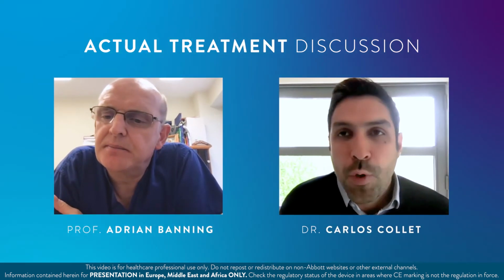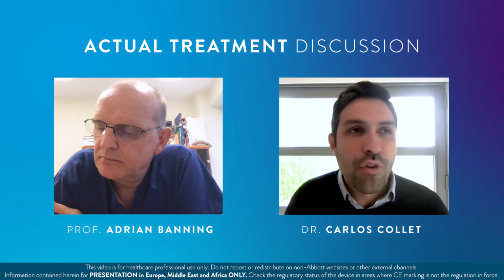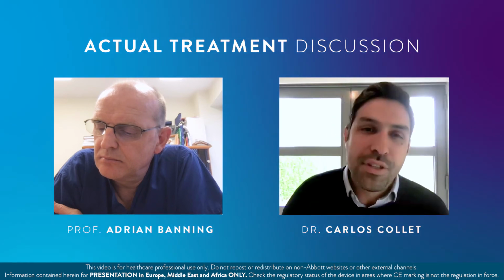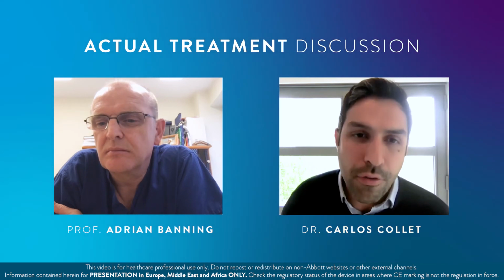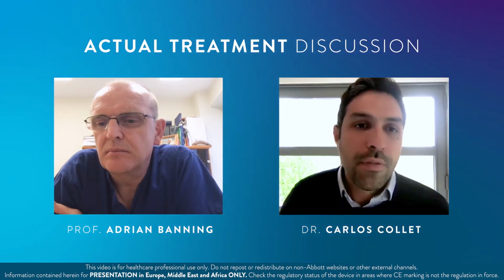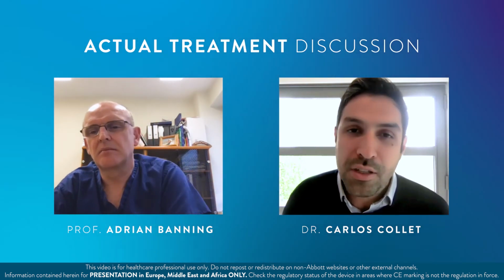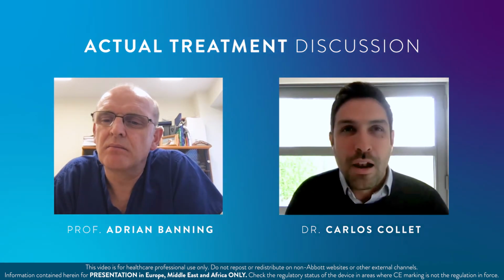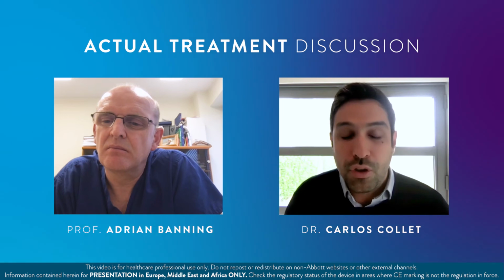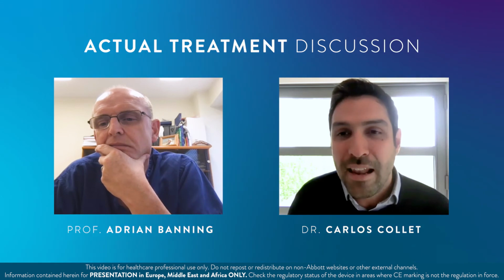So yeah, we're really happy with the results on the main branch, and just to give a summary of the levels of decision in this case. First, we identified that it was neointimal hyperplasia. Then we were confident to use the drug-coating balloon. Then came all the technical difficulty of the procedure, but then we finished with an OCT that showed a very extensive dissection. And as you mentioned, Gabor, the length of the dissection was extremely important for us to select the length and the diameter.